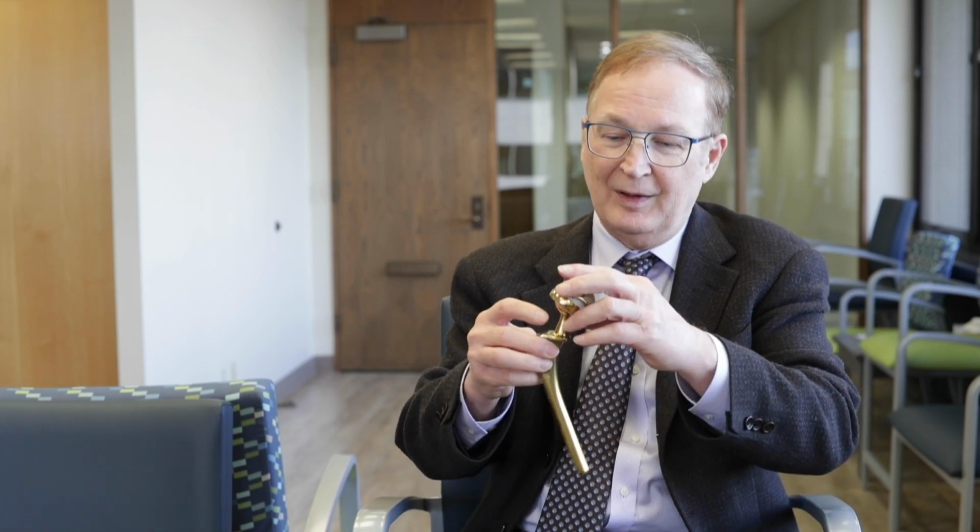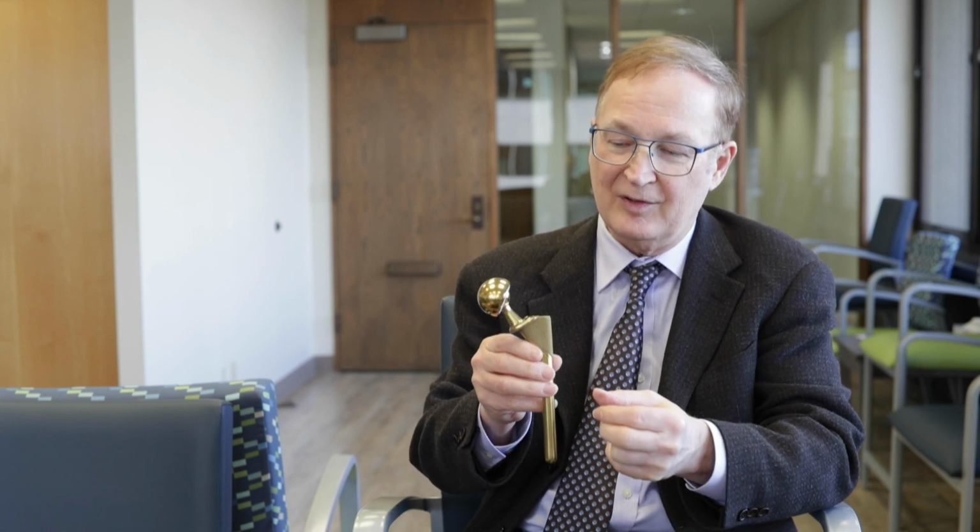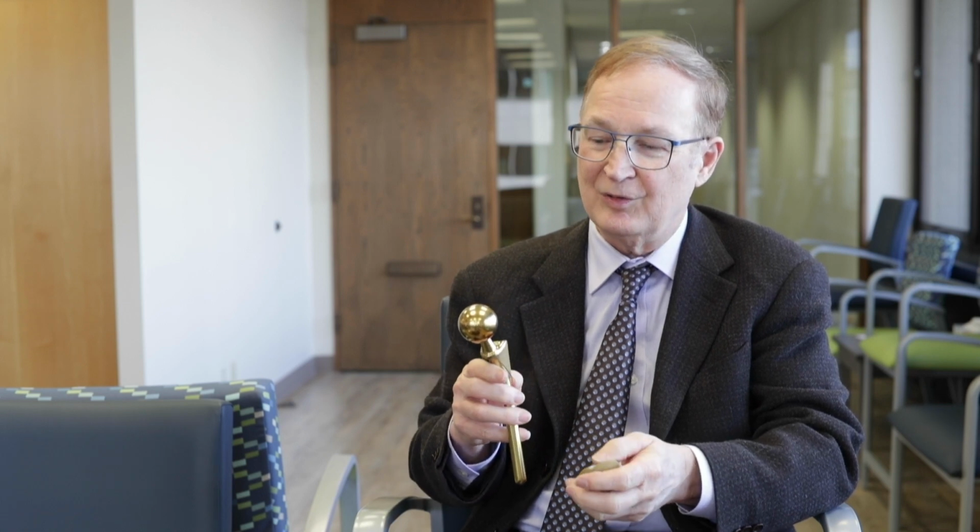So the additional step that has been the full answer is to coat it. The implants, they come out a gold color when you do that. It still has the same texture. Obviously, the shape and size of the implant will vary according to the patient and its use. But if you put a gold coating, which is ceramic, on it, then this will be non-reactive in the body. And our patient Christine that we had here earlier, it will be permanently. If you won't react to it, and you never will.